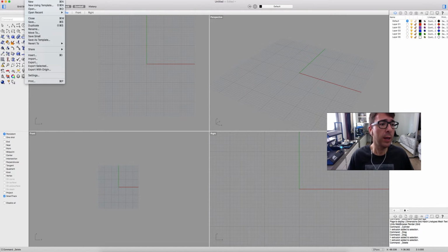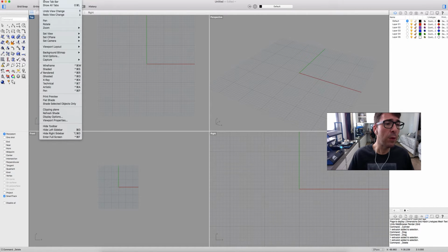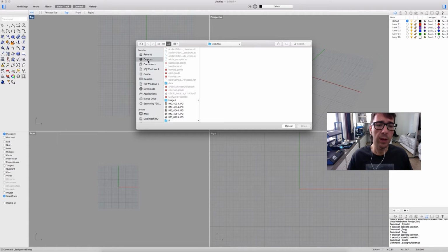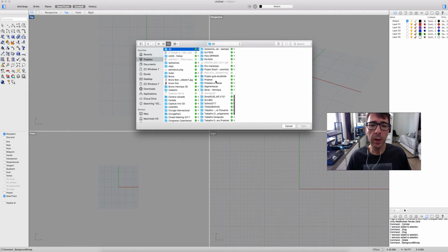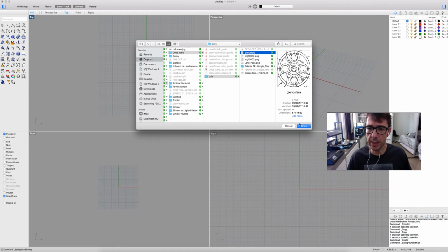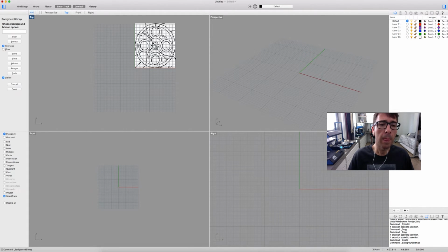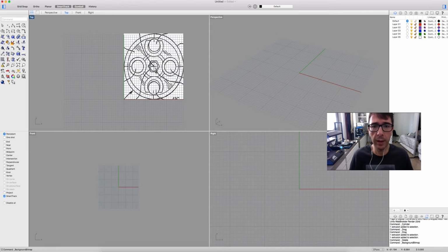We are going to create it in Rhino: View, Background Bitmap, Place. We're going to select where our file is. So let's go to our 3D Delta Xtend PDFs, and this is the view we want. Now we can place the image right there. Hit done, and now we can draw over the image.